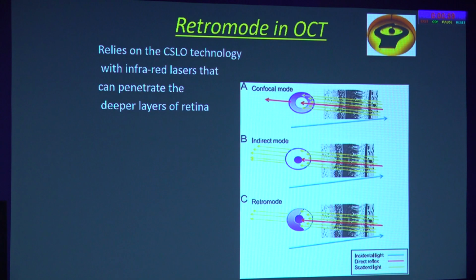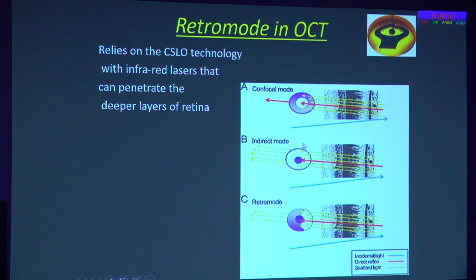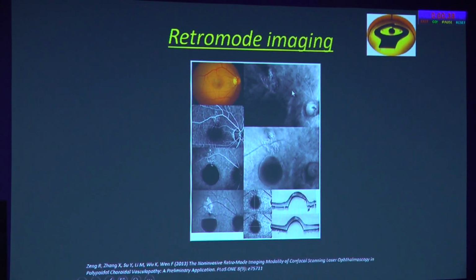Something called as retromode OCT, which is again not very new, but it uses the CSLO technology with infrared lasers. We know that in confocal mode, the reflected light is passed through the center. Indirect mode is where the refracted light is passed through the paracentral one. In retro mode, what they use is the laterally deviated light. How it is useful in practice is that this retro mode can actually show us the lesion more clearly or in a more elevated form.